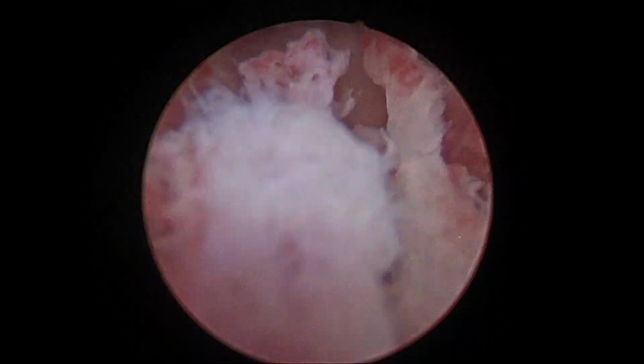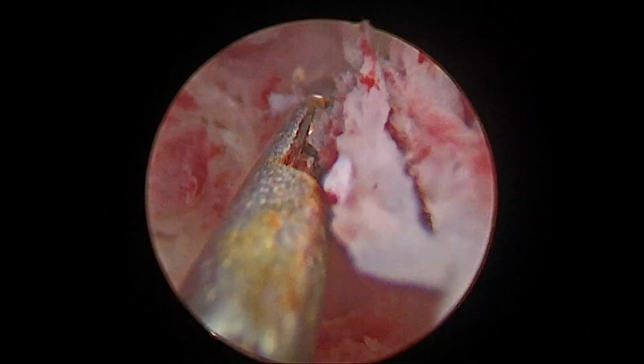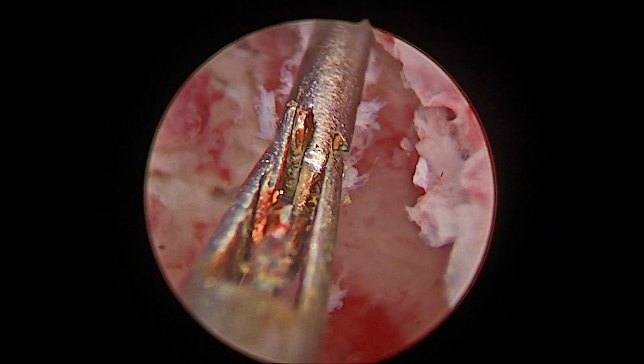But later we saw that near the cornu, a piece of copper T thread was also seen embedded near one of the cornual ostia, which was again removed using the hysteroscopic grasper through the operating sheath.